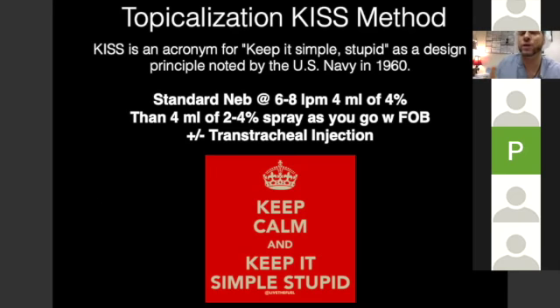Now, you wouldn't want to do this on a patient who has intracranial hemorrhage or elevated ICP, where coughing would be of consequence, or a very unstable spine. So this is more for that abscess guy.